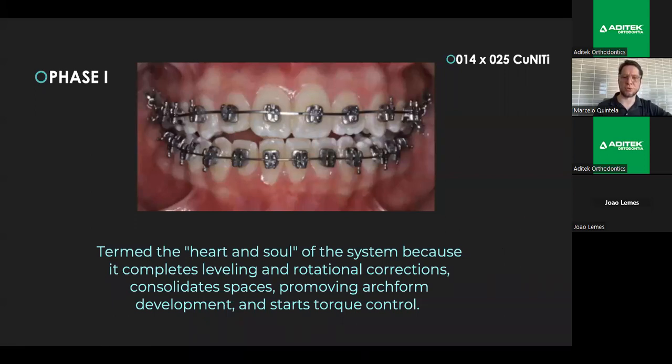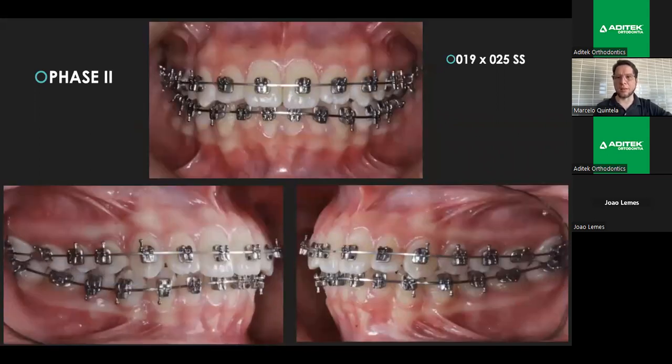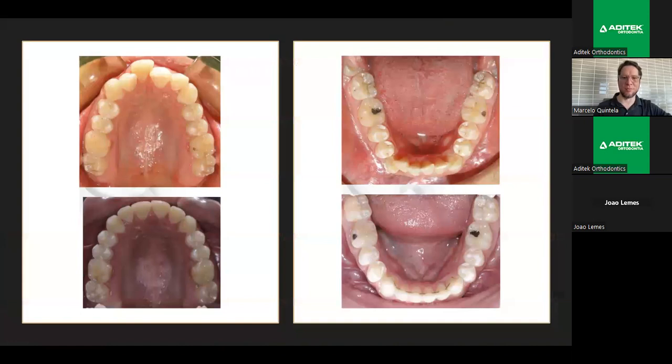The transversal posterior adaptation. Look, the lateral photographs. And now, with all torques expressed with a stainless steel 19 25. And final, 12 months of treatment. I would like to speak in English about how I do that in these cases. Look, before and after.